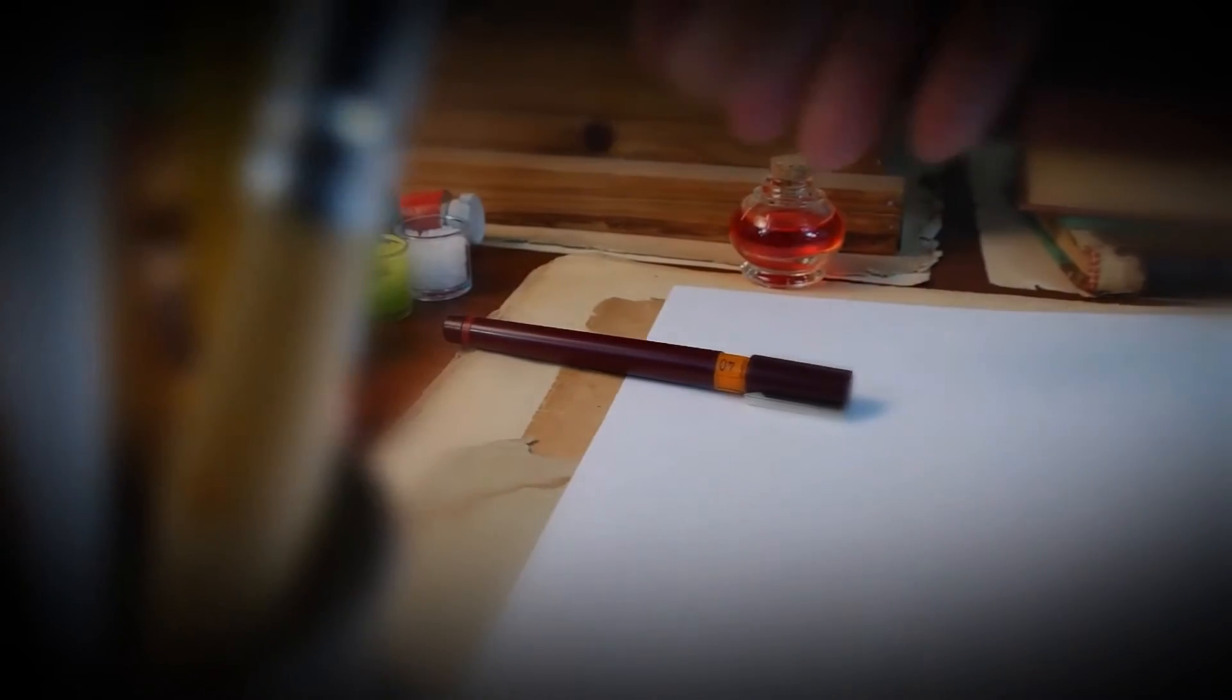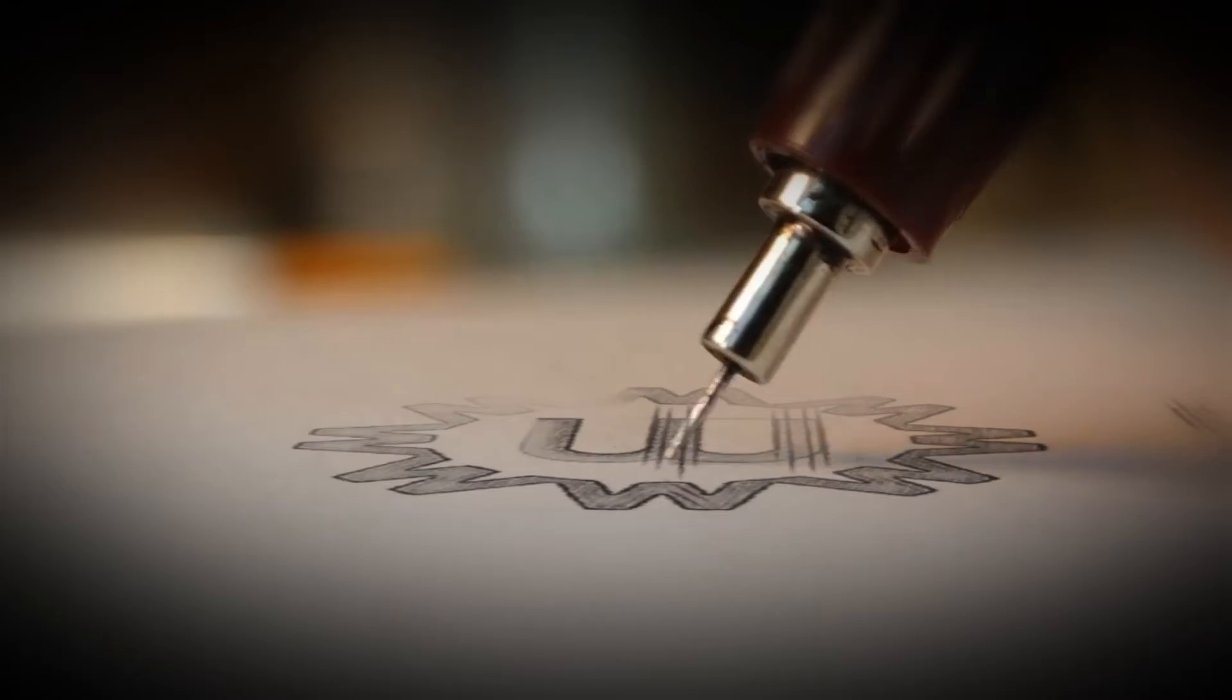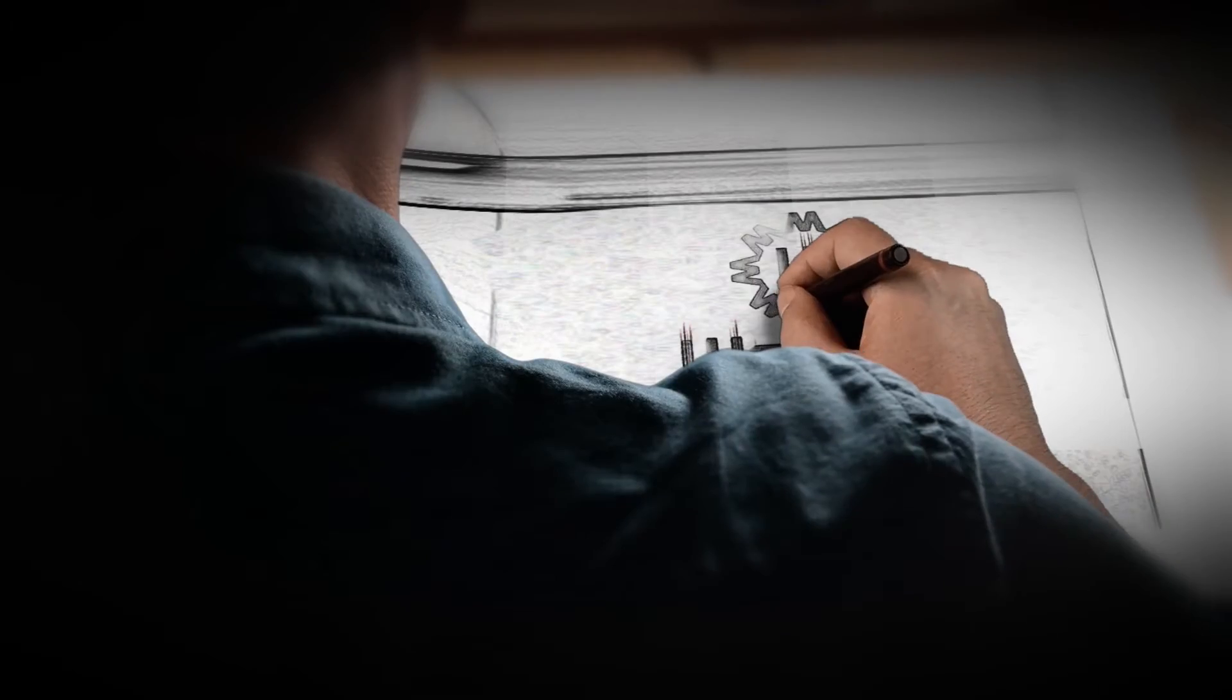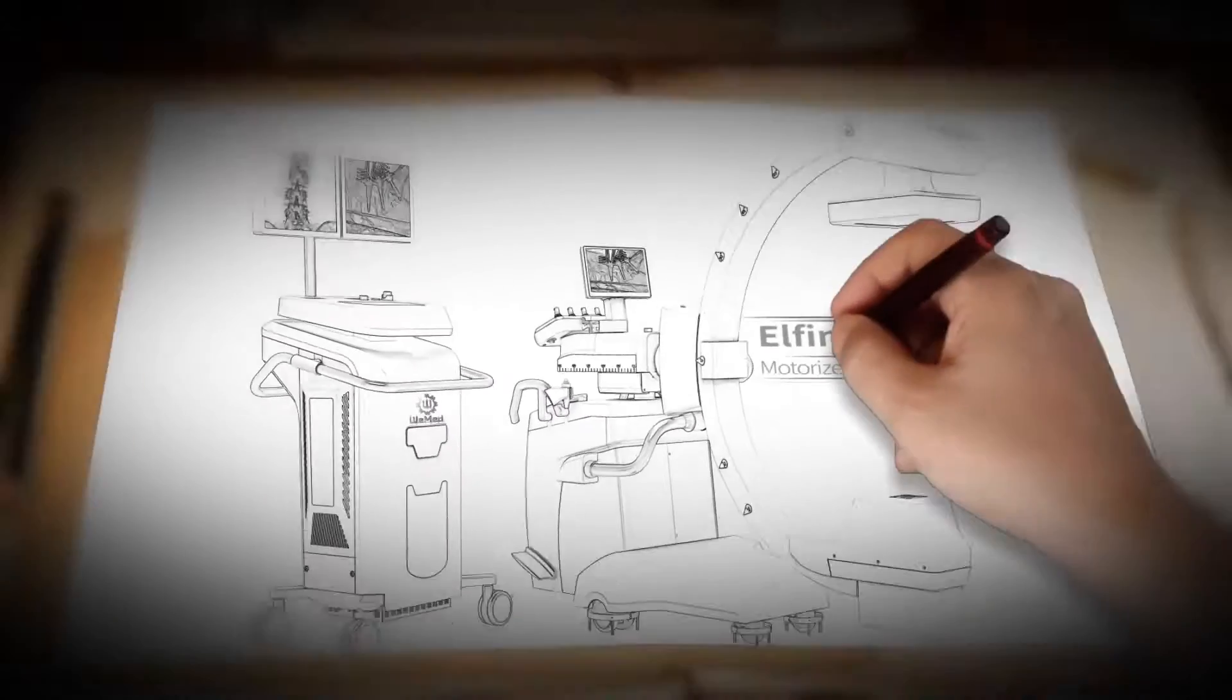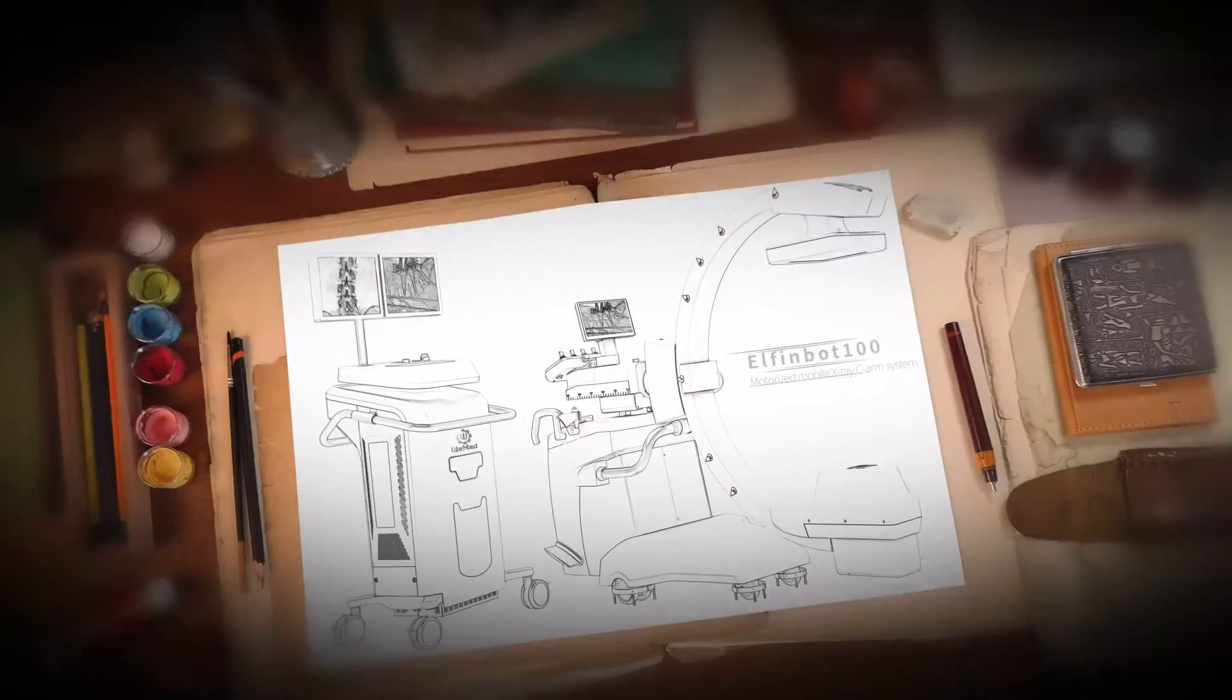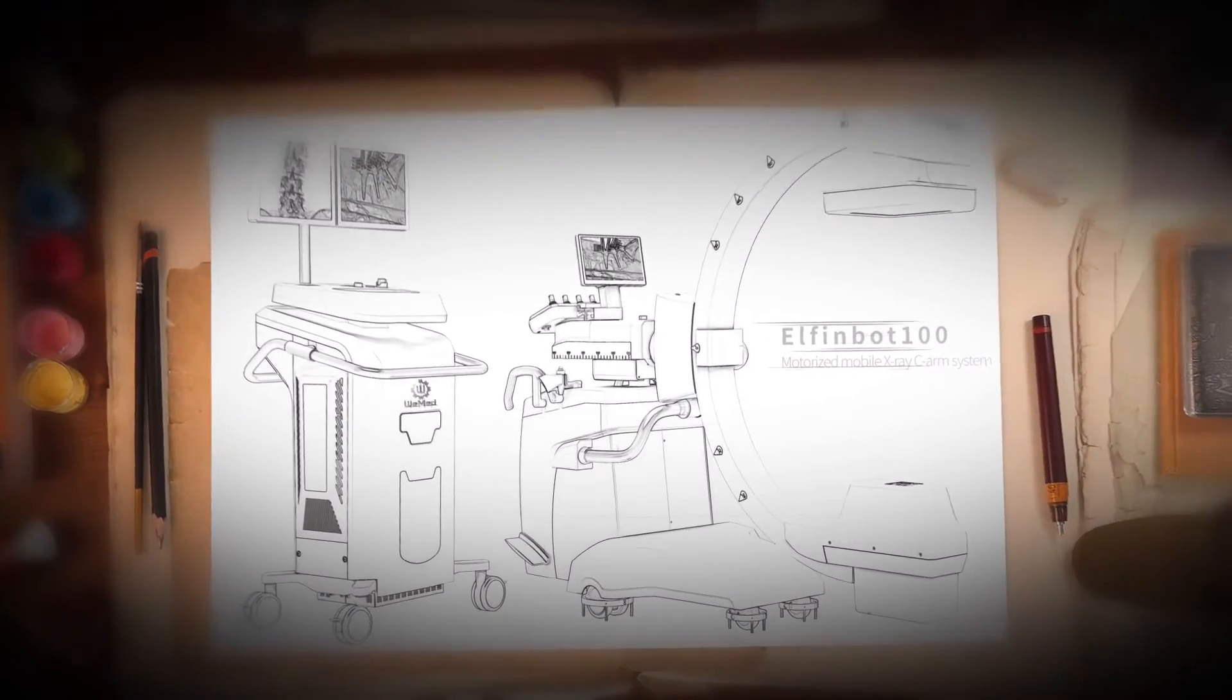As a professional provider of interventional products and solutions, WeMed Medical produces intelligent motorized flat-panel detector C-ARM system, ElfinBot 100.